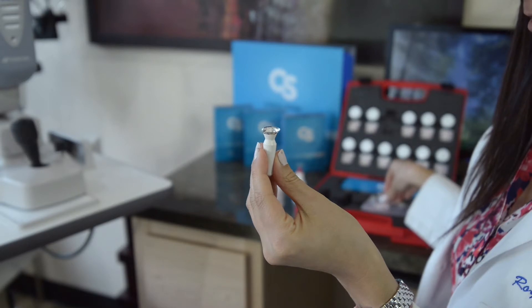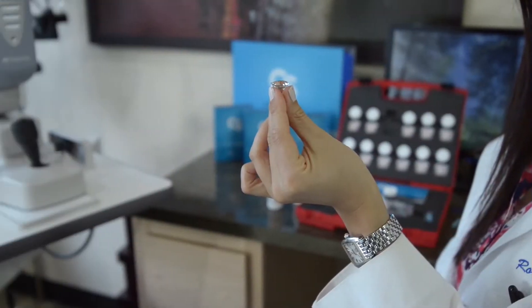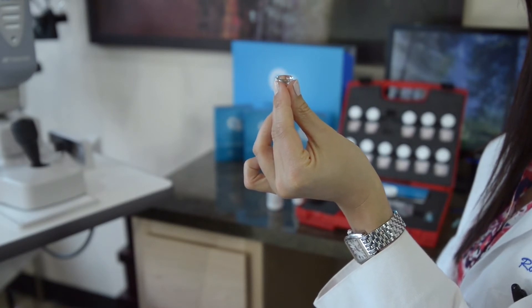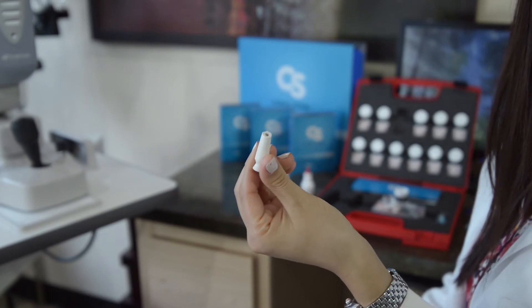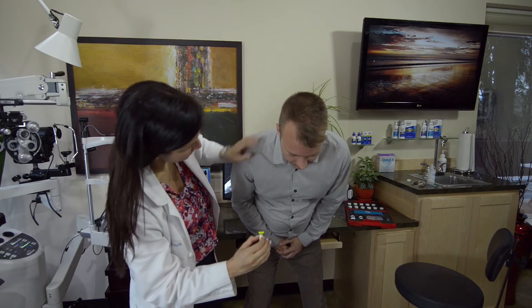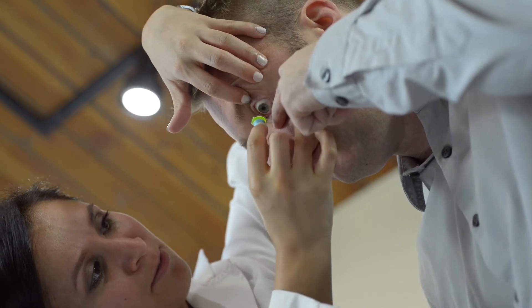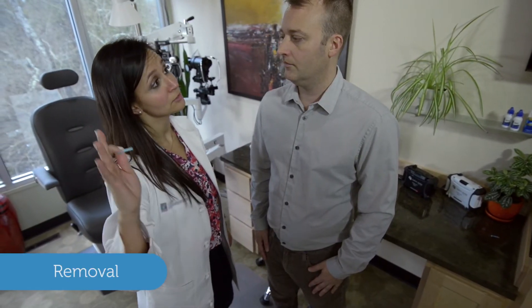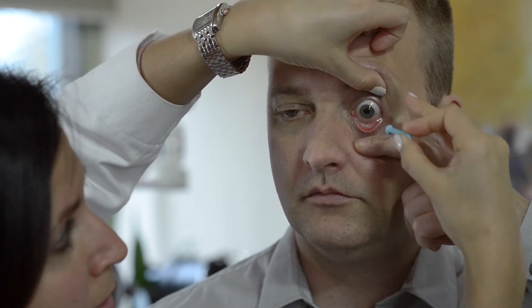Once the lens is filled, dip a fluorescein strip in the saline-filled lens to allow you to analyze overall clearance. While holding the lens, you can either use the DMV application tool or utilize your fingers to form a tripod. If you utilize a DMV tool, we recommend snipping the end to eliminate suction — otherwise, squeeze the DMV tool to release suction once placed on the eye. Have the patient bend over parallel to the floor, touch their chin to their chest, and stare at a spot directly below them. Have the patient gently pull their lower eyelid down, while the fitter holds the upper eyelid open and applies the lens directly over the cornea. To remove, use the included smaller plunger tool, applying it to the periphery of the lens and gently pivoting in a slight rocking motion to break suction. Never pull the lens straight out from the center, as this can cause unwanted pressure and suction on the eye.